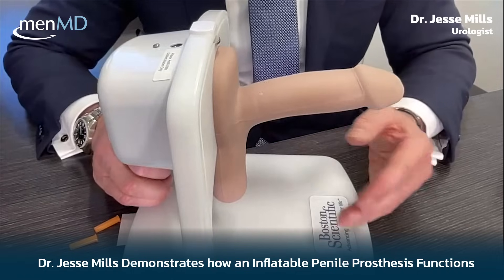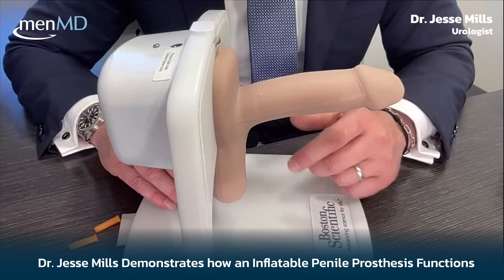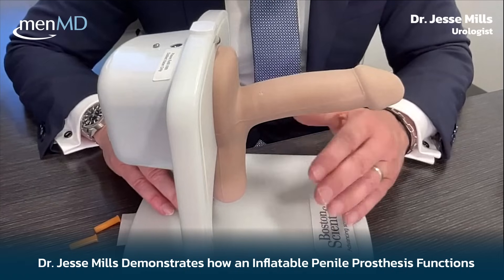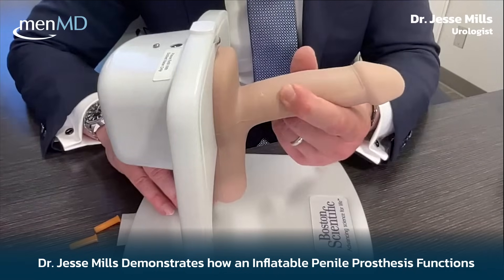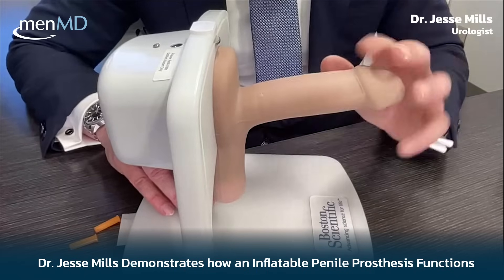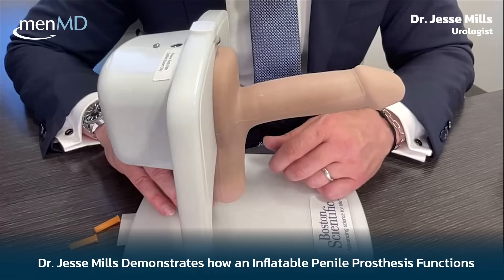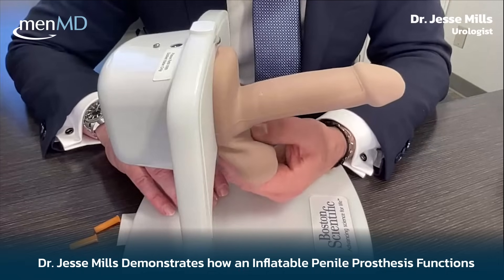If I push on it as if having intercourse, you can see it's pretty durable. Some people ask, 'Will it be as hard as my erections used to be?' One issue I have with that question is you may not remember how hard your erections used to be because it's been so long since you've had a good one. Rather than answer that, I say: it will be hard enough that you should be able to have penetrative intercourse. There's still a little give, but for the most part this is a rigid erection that allows for resuming penetrative intercourse.